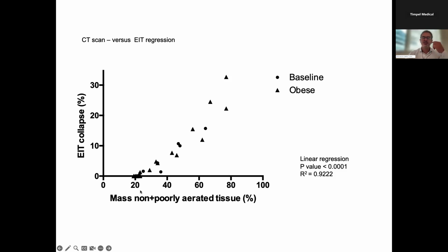On the other hand, it actually helps you navigate the PEEP levels that you are willing to apply to your patients. Let's say this patient only opened this remaining 20% at PEEP levels that would give you plateau levels at around 60 centimeters of water, for example.